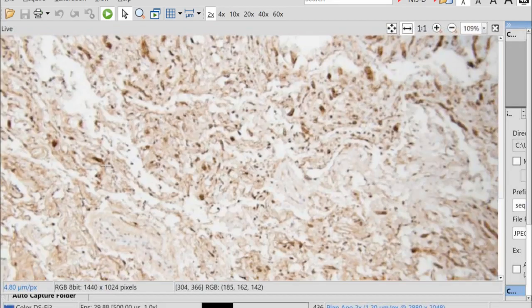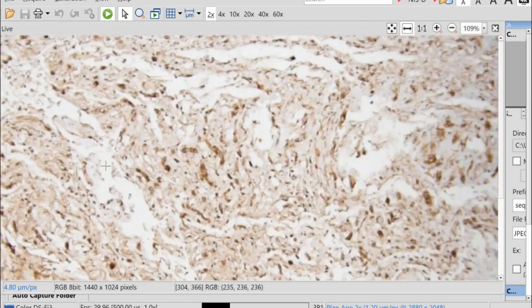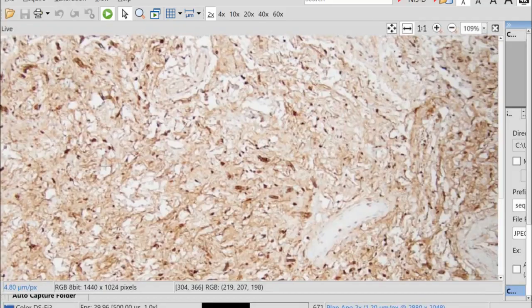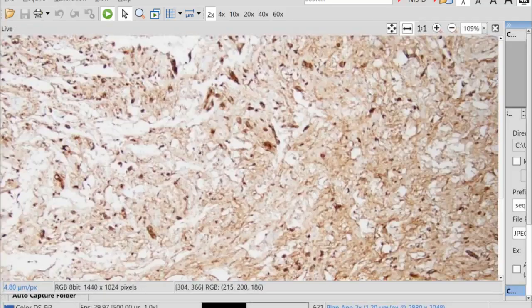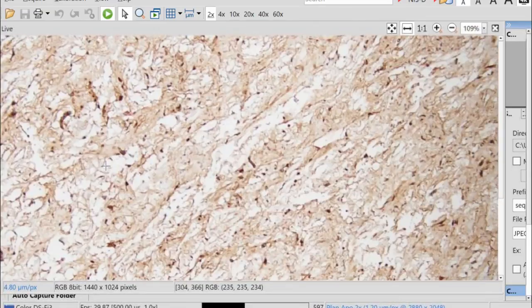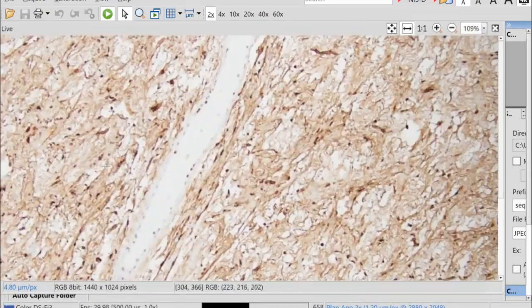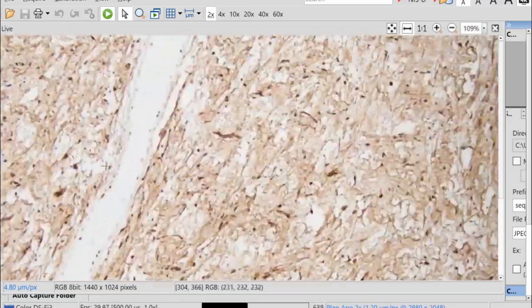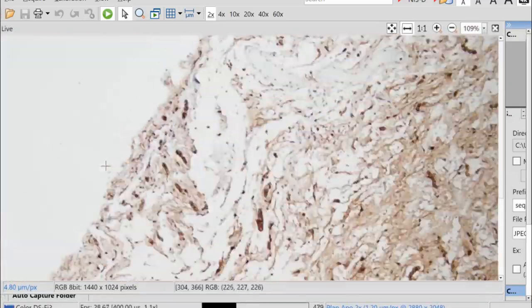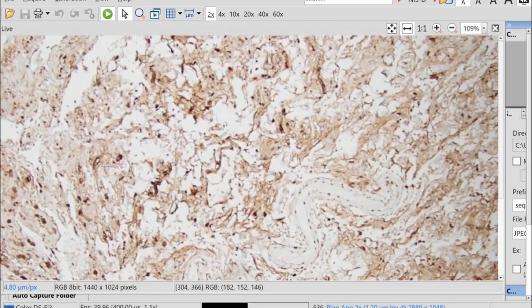But compared with other tumors that we were seeing, you see there is S100 also highlighting part of the axons. But you do have really a feel that there are other cells that are not quite S100 positive. So the density of S100 is a little bit more modest. This was a clue that probably you have another component as well.